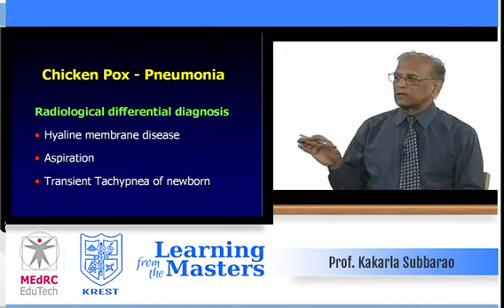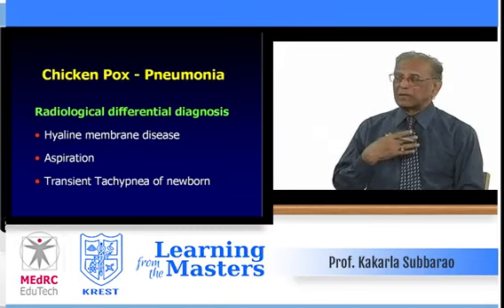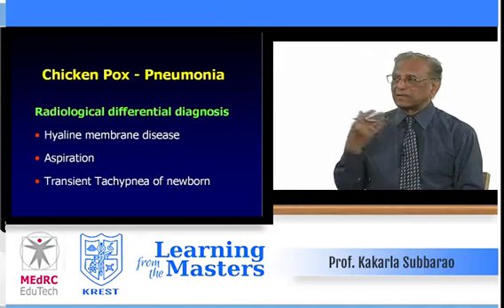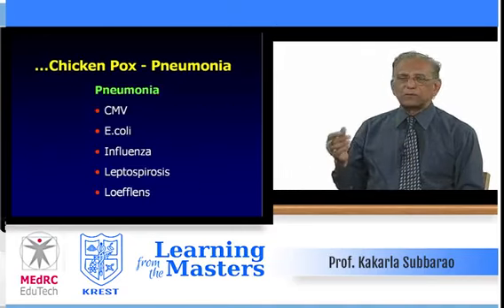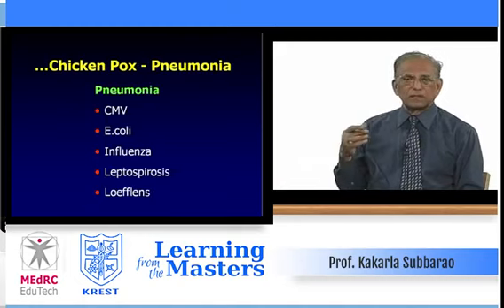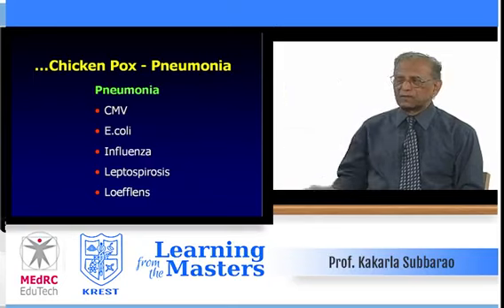Chickenpox pneumonia, radiological differential diagnosis, in children particularly: hyaline membrane disease, haziness, aspiration pneumonia, transient tachypnea of the newborn. Second, pneumonia simulating cytomegalovirus infection, E. coli, influenza, and the rest of the things.